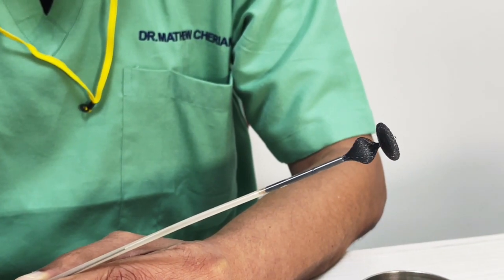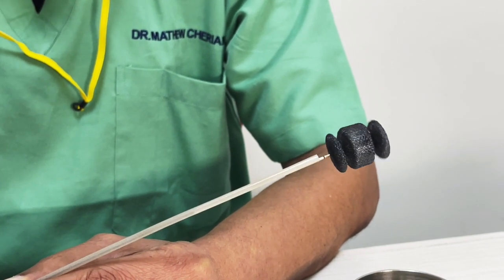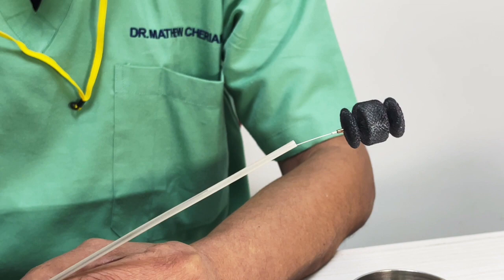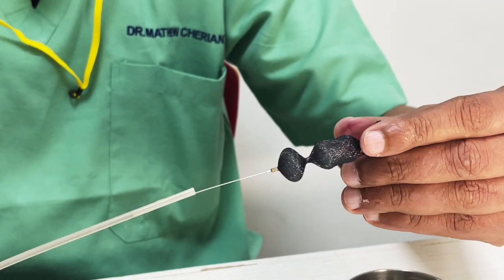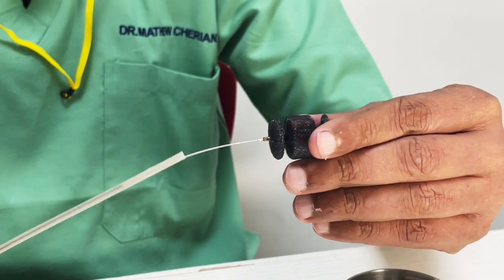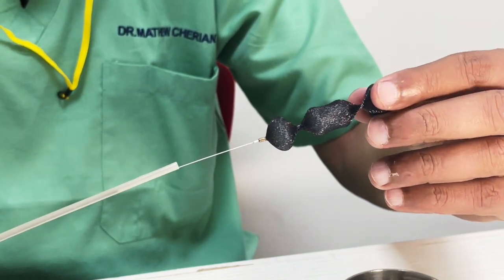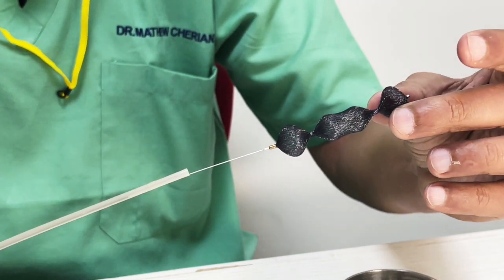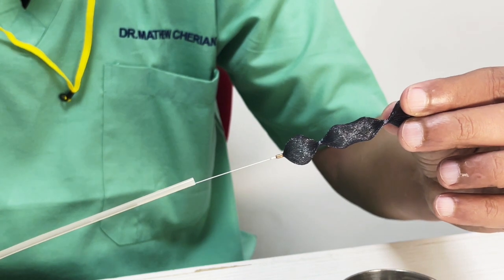So this comes like this and comes like this and it closes. Look at that, you've got three bulbs. In a real life situation, in a blood vessel, it's going to look something like this. It's not going to look like this because you're oversizing it, right? It's a tight nitinol mesh, and one single plug like this will do the job of 10 coils in a large vessel.